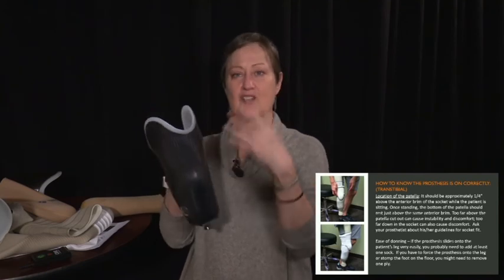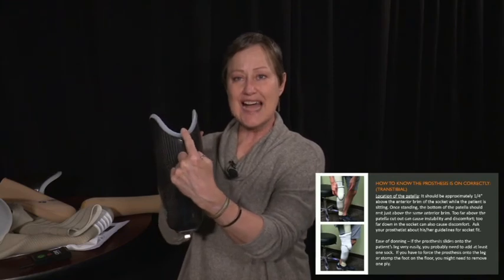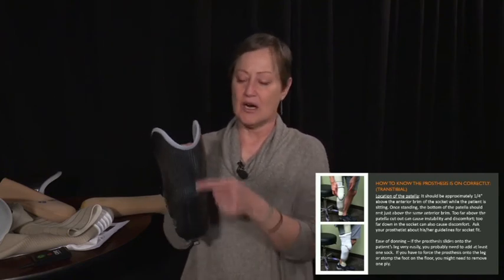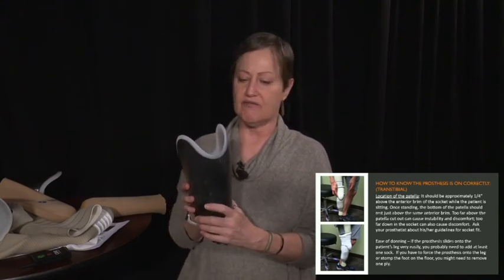Not wearing enough socks, your leg has shrunk, you fall down. Some patients, that's where their primary pain is going to be. Oh, it hurts right here on my kneecap. That tells you probably need to add a sock. You're falling down too far. Make sure you look at that, and again, let the prosthetist know what you found.